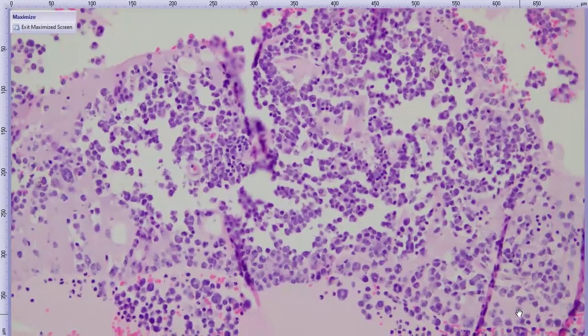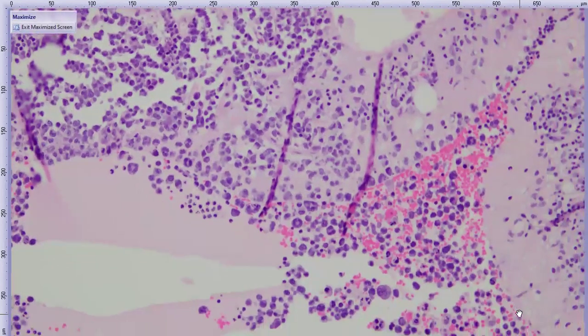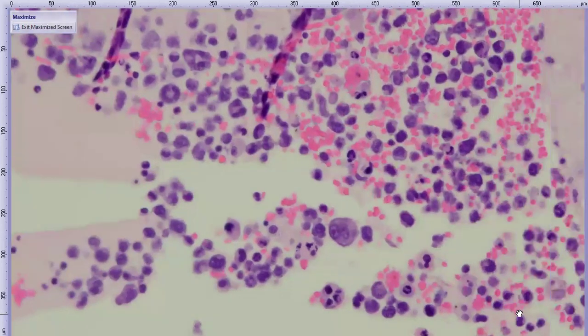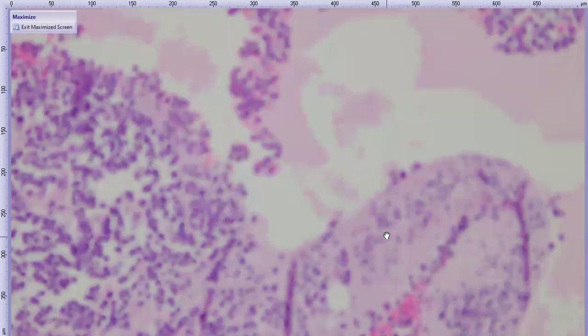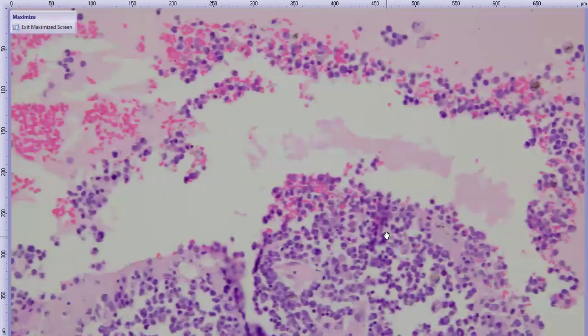They're round cells, and sometimes they kind of look mixed morphology from low magnification. But as you look around at them, they actually start to look quite ugly, and many of them are binucleate or multinucleate. They have an open chromatin pattern, often with distinct nucleoli. We can keep looking around and prove to you who this population is.